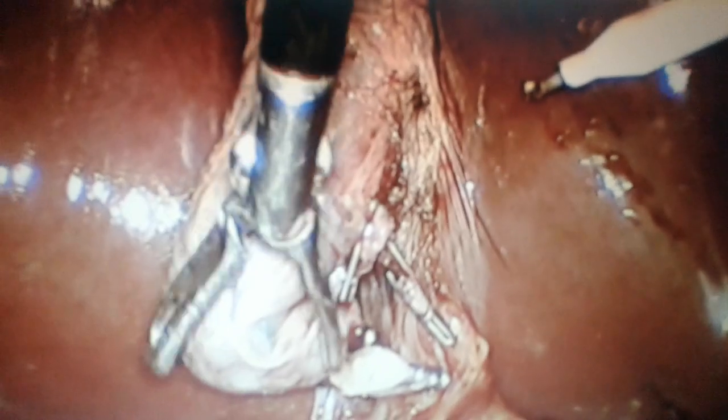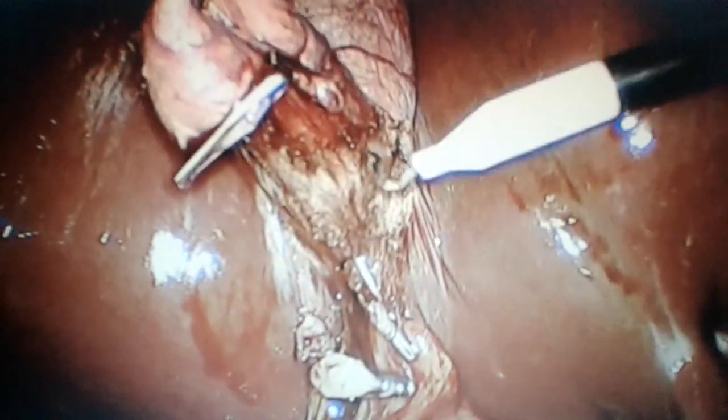You can see the gallbladder is being removed from the gallbladder bed. Presently the clips are in place, and very common condition, sometimes it may arise like this, small leakage of the gallbladder content.